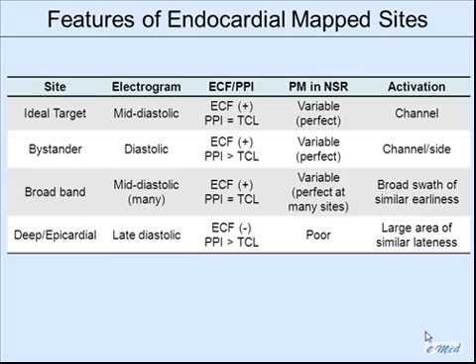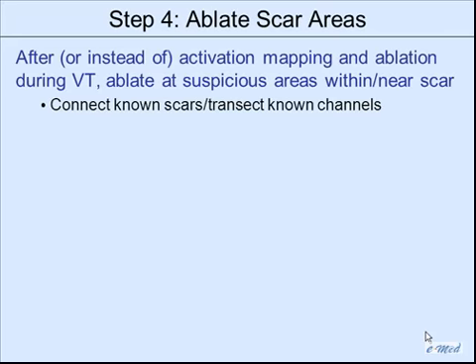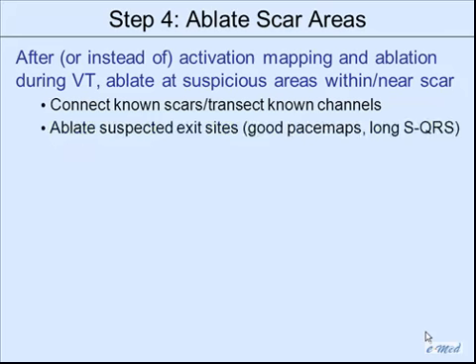Again, this will be on your presentation. We'll spend more time here. Now, let's ablate some scar areas and see what we can come up with. You can, various strategies here. You can connect known scars, transect known channels, ablate suspected exit sites. All of these have some data for them with careful investigators that are not so easily reproducible by other investigators.